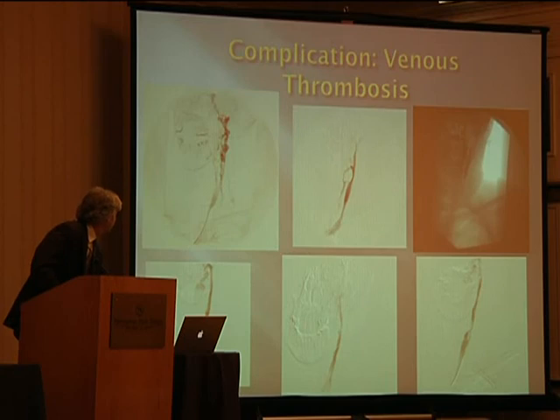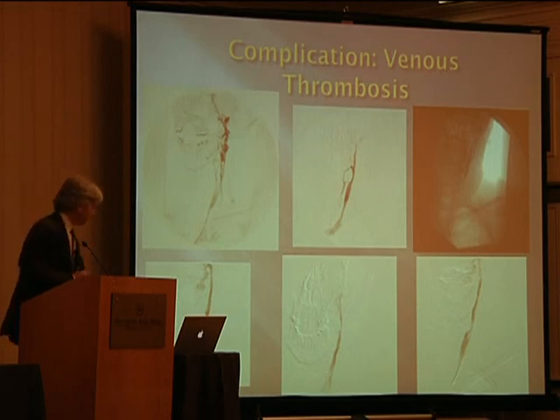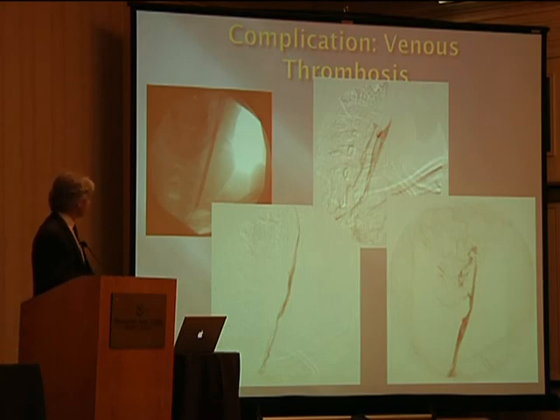This is a case of a very diseased internal jugular vein, with collateralization due to the vertebral system and lots of stenosis throughout the vein. We dilated the vein with a relatively good result, but ended up with a little bit of thrombus. We tried to macerate it with a balloon and ended up with a vein that eventually just clotted off completely. That required TPA thrombolysis and Fogarty balloon thrombectomy. We ended up with a nice result in the end, but this was a case that happened before we started heparinizing people.